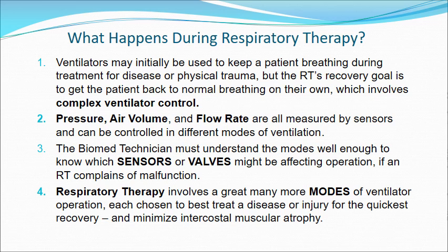It's important to realize that modern, newer ventilators are so intelligent, it is very difficult to test their function. Usually they have self-tests, but they can be monitoring and making decisions on so many different parameters that it's virtually impossible to do anything other than simply changing filters. However, for many of the ventilators, especially transport ventilators, which you are dealing with, their functions are far more limited.